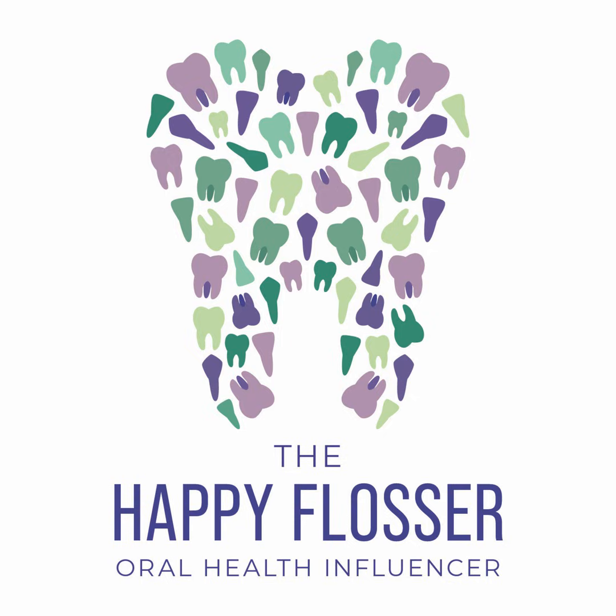When you have vertical angulation to that crestal contour, the crest will have an angular contour on adjacent teeth if the teeth are erupted differently or tilted. And so sometimes this is still considered normal or within the normal range. If there's a parallel line drawn between the two teeth, the CEJs are still 2 millimeters above that level of the bone.